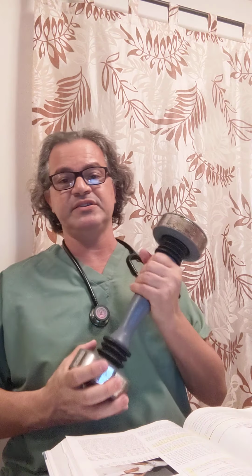Another equipment we use, more in the hospital, where they really need assistance from the clinician, is the percussor. Let's say this is the percussor, and it's connected to a machine. Usually we start from a low frequency and go up.